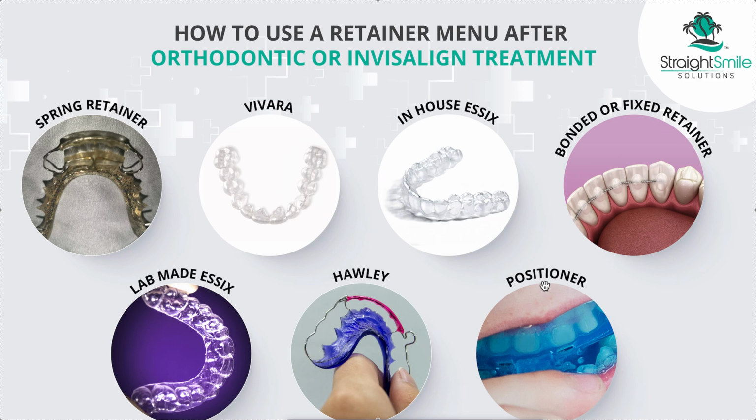And they can't be worn when you have nasal blockage or if you have the flu or allergies. You're not going to be able to wear it, because you're not going to be able to nasal breathe well, so it's probably going to spit out at night. You do need to wear it at least 14 to 16 hours a day, at least initially, and then you can eventually go down to night. So this is the only retainer that isn't initially worn full time. I know there are probably some people who don't have their patients wear their retainers full time, but I completely disagree with that. And I've definitely experienced weird things that can happen when you don't do that. So I prefer to play it safe.